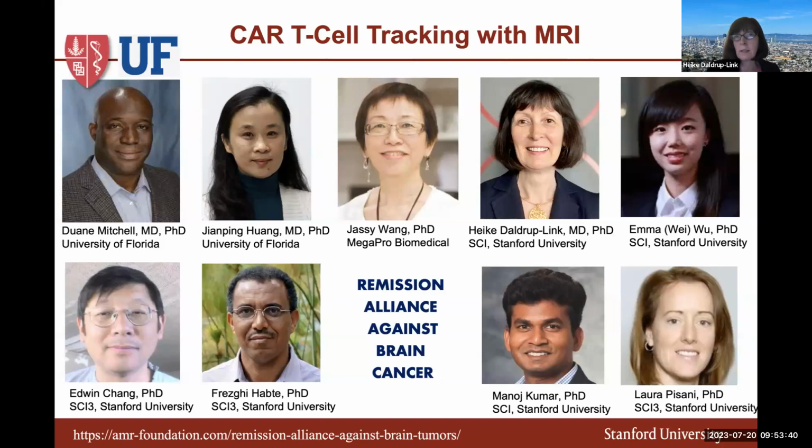They routinely undergo MRI, but they would not routinely undergo a PET scan. So again, we would not need to change any imaging schedule for these patients, but we just label the therapeutic cells with nanoparticles and then track them in vivo. So hopefully somewhere in the near future, I will have an update on that.